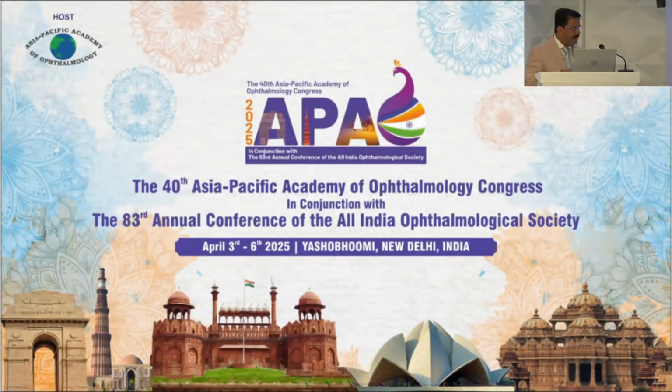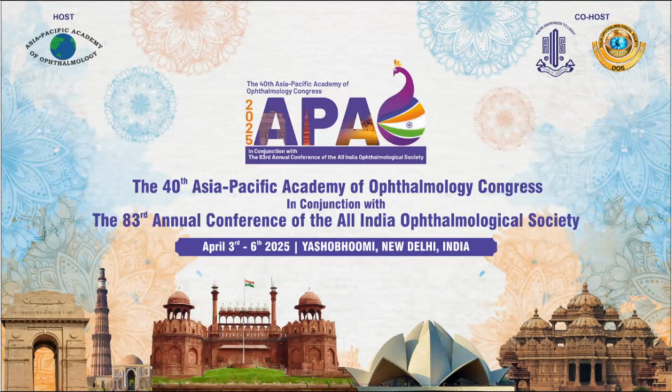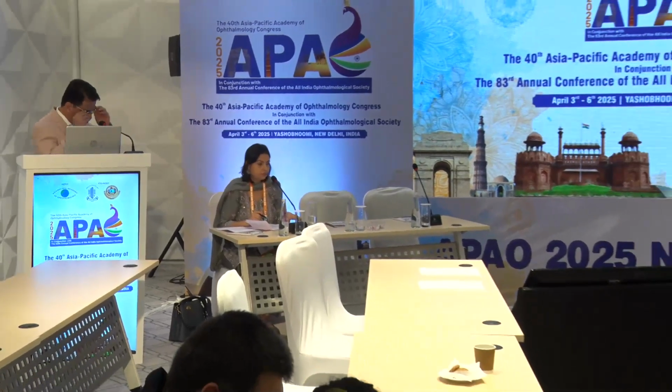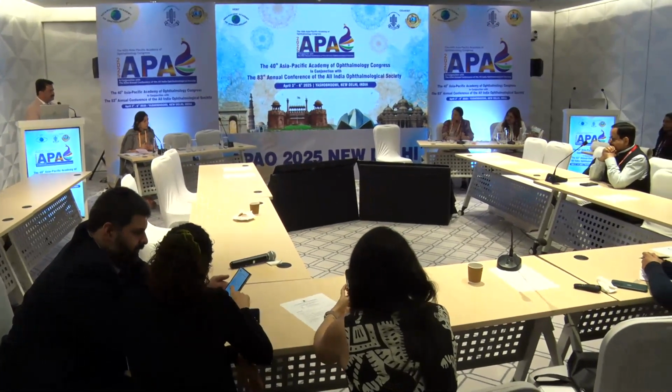Very fine presentation, Dr. Ladi. Thank you. And when you're talking about air bubbles, this is useful only in lenticule dissections? Only in SMILE, ma'am. In SMILE surgery. And the air bubble, you're not injecting, it is the atmospheric?